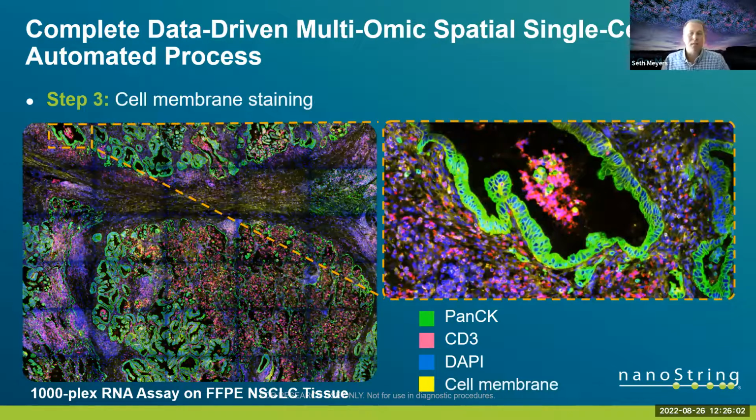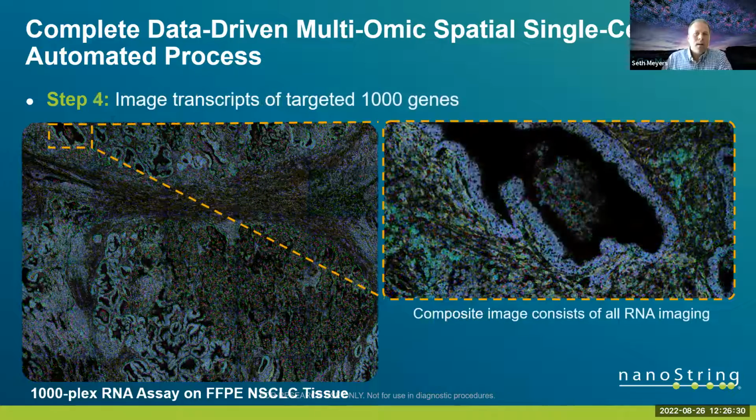We also dedicate a channel to cell membrane identification, which is very, very important for being able to perform single cell analysis. For the majority of tissues, we use a cocktail of B2M and CD298, but it really works well for the ability to use others as well. There's certainly a customizable option of looking at different cell membrane features and tissue cocktails that we can use from a protein perspective to ascertain the cell membrane staining as well.